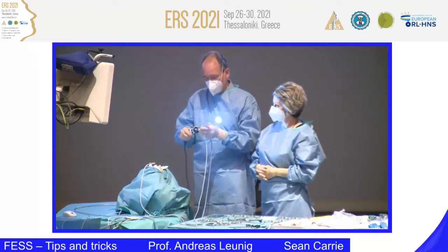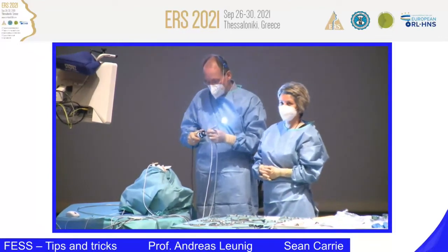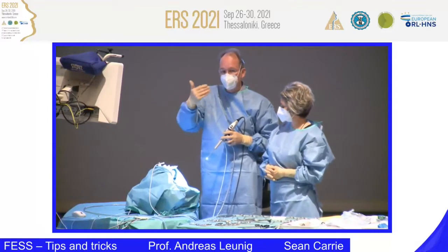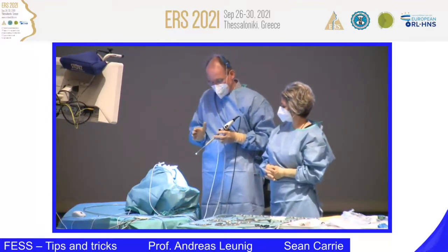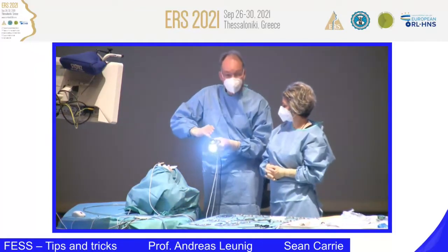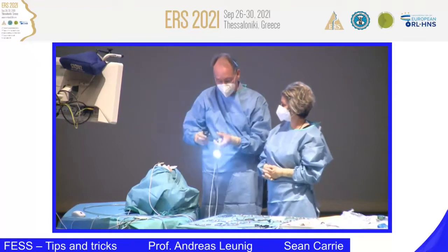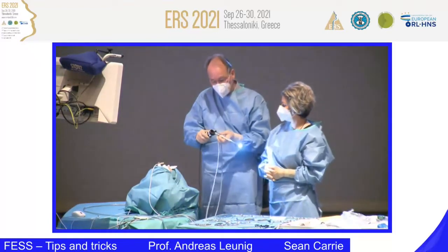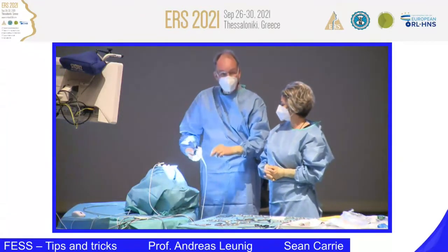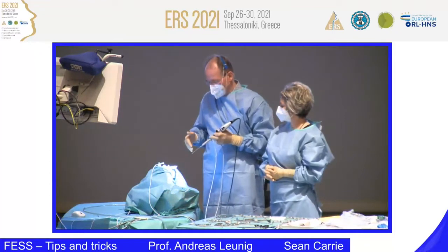Very important, you have the camera and you have your endoscope. You could have an HD camera or even a 4K camera, which is nice, the picture is a bit brighter, so it's up to you and to your administration what you get. Very important in the handling is, first, you look into the camera and you clean it very, very gently, please pay attention, but sometimes there's some debris on it and you always have a bad picture. It's the same on the ocular and on the tip, and it should be in good quality, so you can check it here, the light as well, if there are broken cables or not. So these are things you should know, and then you're more happy with this kind of procedure.